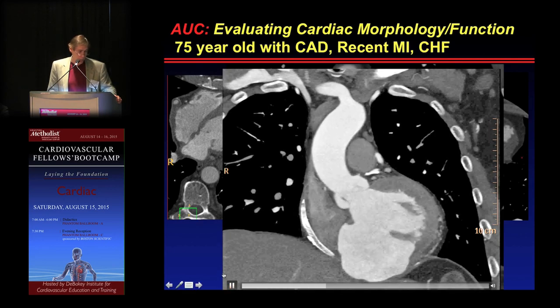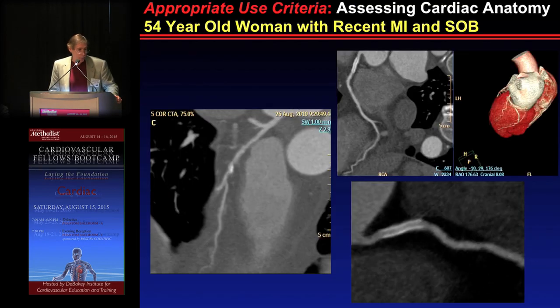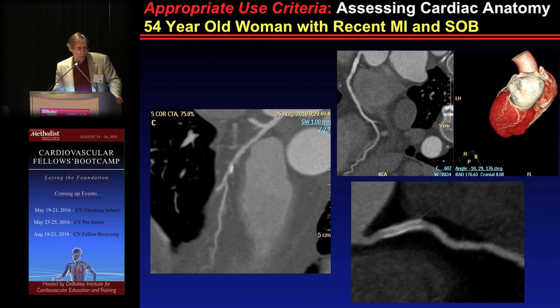You can see this is another patient with, again, a huge pseudoaneurysm, this time involving the inferior wall. This is the left ventricle. This is the pseudoaneurysm.